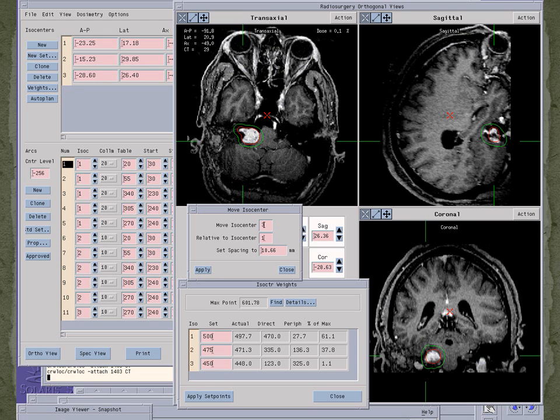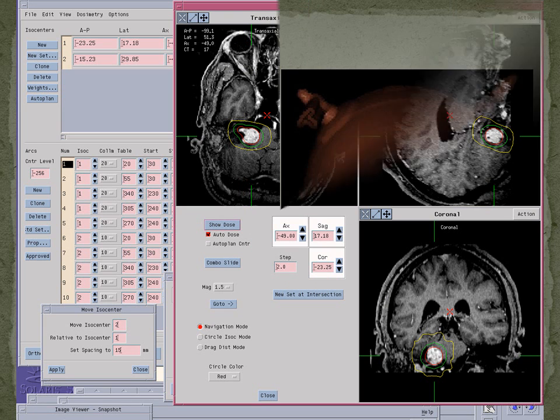The system you're going to see today is our in-house system. It's a system we developed at the University of Florida and one we use for day-to-day planning. There's a commercial version of this that we actually have down in the lab. And so if you're not here, there is another version of this. We use that version to check our plans on a daily basis because that is the FDA version that we rely on. They give us the same answer.